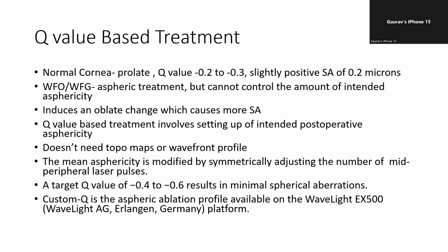So the US FDA was actually doing trials for Topo Guided treatments when they insisted on doing trials on virgin eyes. They wanted to prove that at least on virgin corneas it is as safe as the wavefront optimized. That was what the FDA wanted. That is why the initial trials were done, and they found that they actually improved the results on virgin eyes as compared to wavefront optimized, which was a surprise for them. They were only doing a trial to see whether it was as good as wavefront optimized and no other complications were there. So that is how this Contura was born basically.